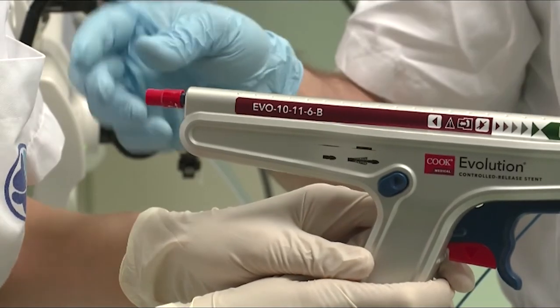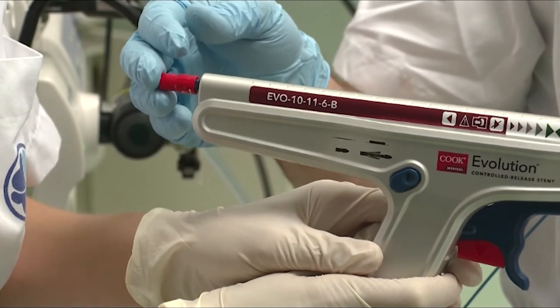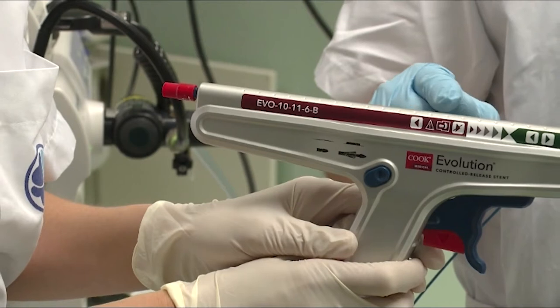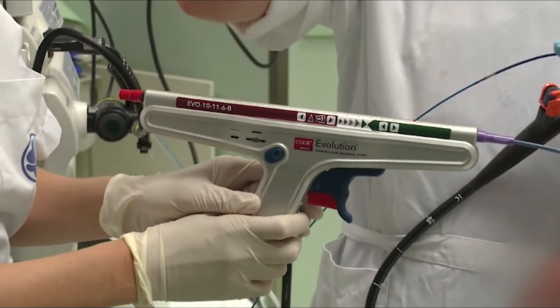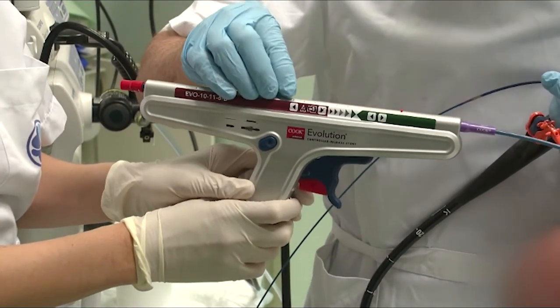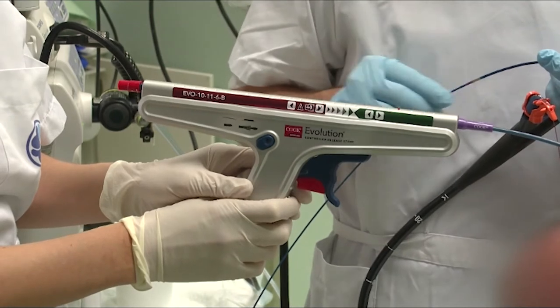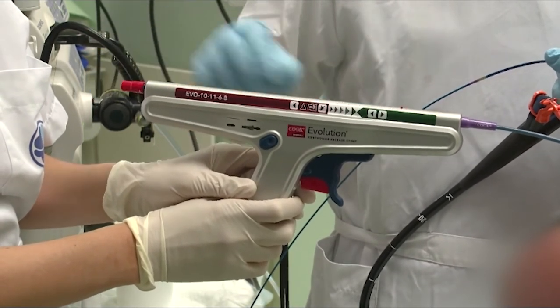So at the end of the device we have the safety wire. The safety wire we have to remove at that point in time when we have almost completely deployed the stent. So that is when the stent is at a fluoroscopy marker, when we have reached that, or at this point on the device, so the point of no return. At that point in time we'll remove the safety wire and we can fully deploy the stent.